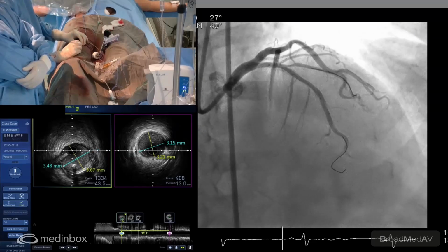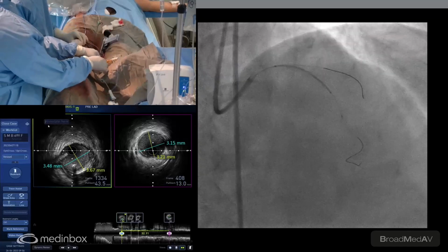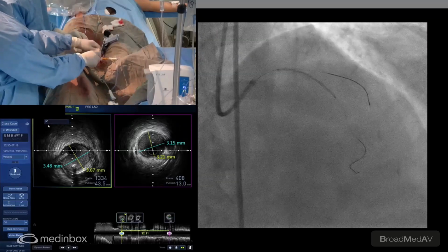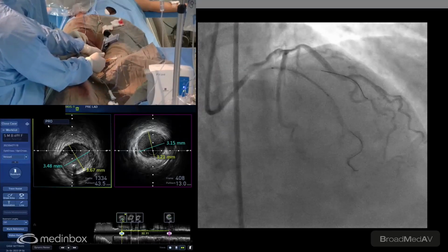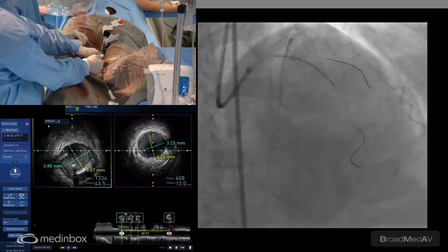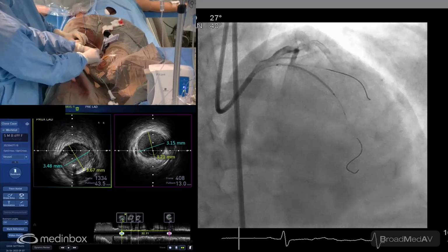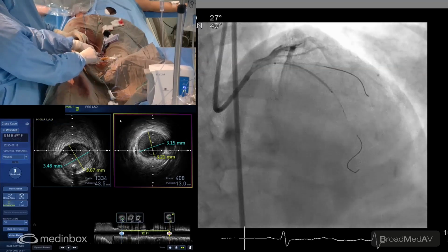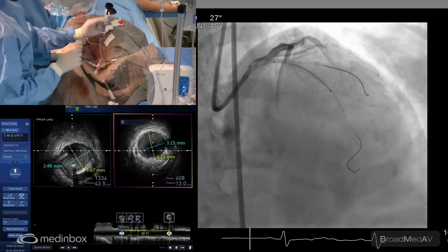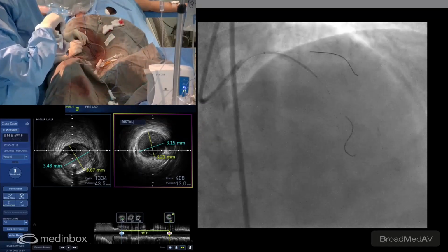So I think we are good to deploy the stent just here. Can we do a millimeter back? One millimeter back should do, I think. Small check, please. I think it's slightly in. Yes, I think this should do. We'll take a small cine check over here. Okay, let's take a cine. Okay, that looks good. Let's go up, please. Keep the 3.0 balloon prepped, please.